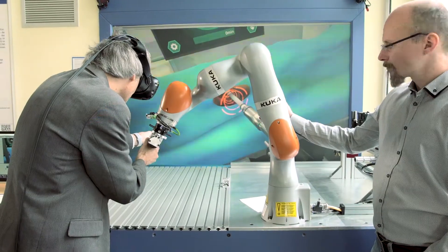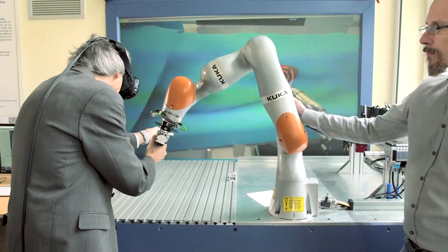The robot plays a very important role in our scenario, because it represents the interface between the real world and the trainee, and the simulated world with the virtual patient.